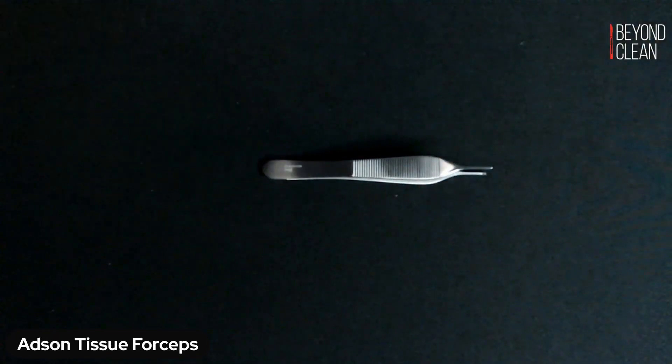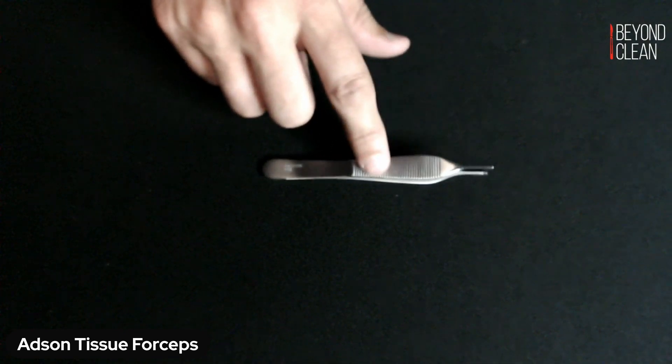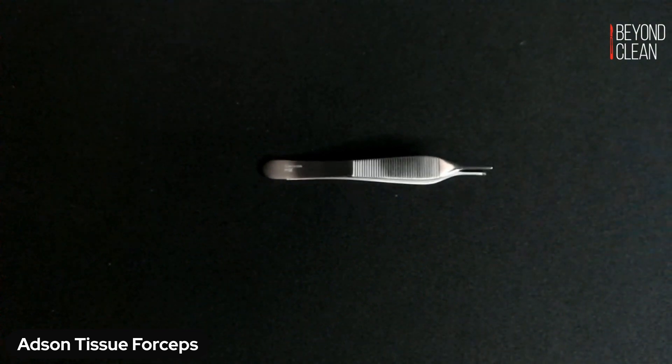All right. So that's the Adson tissue forceps. The only other thing to mention about this is you do want to check those serrations on the handle to make sure that they're clean and clear of any debris.